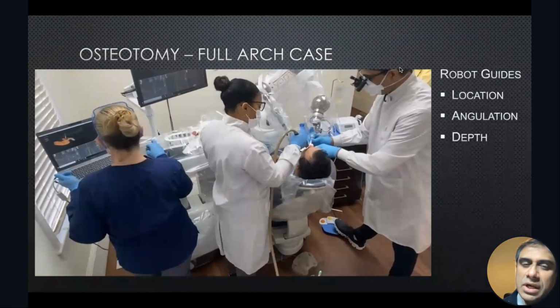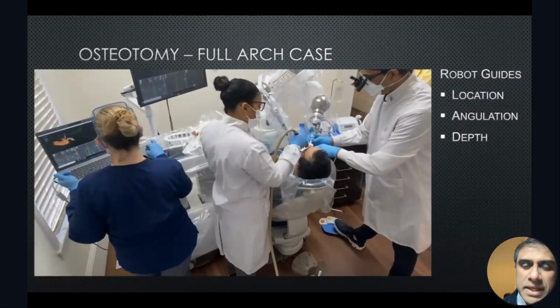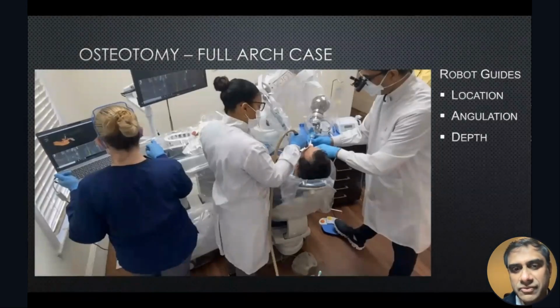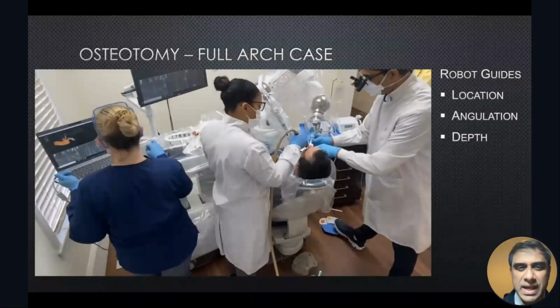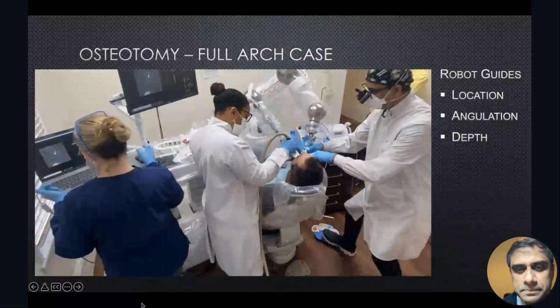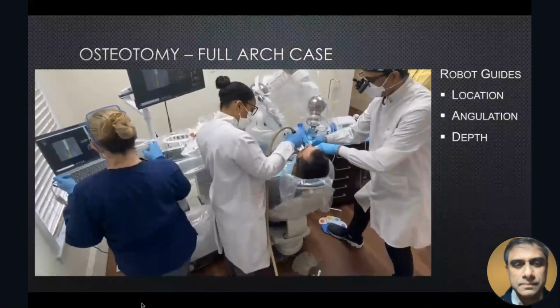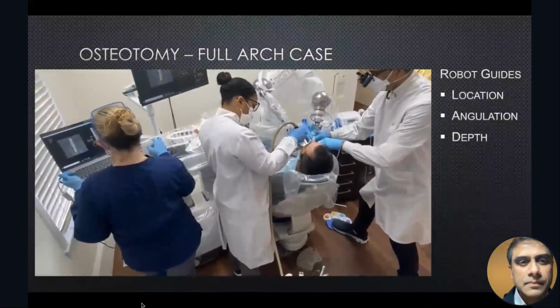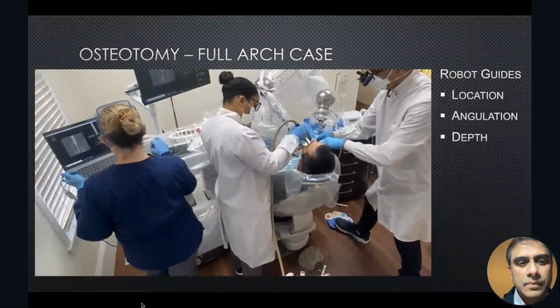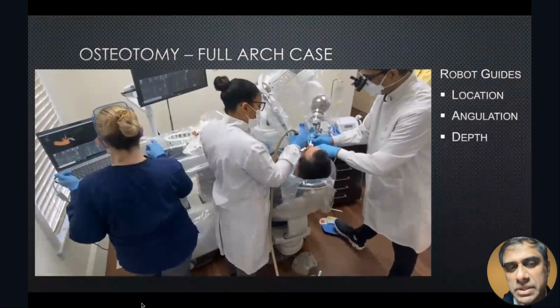But it also starts to give you audio feedback, like a beeping noise, beep, beep, beep, beep. It's telling you that yes, we are at depth. So you don't have to worry about, am I all the way down? Is my osteotomy complete? Here we are, I think I'm getting some audio here. You heard a single beep. The single beep tells us that I was in the right angulation.